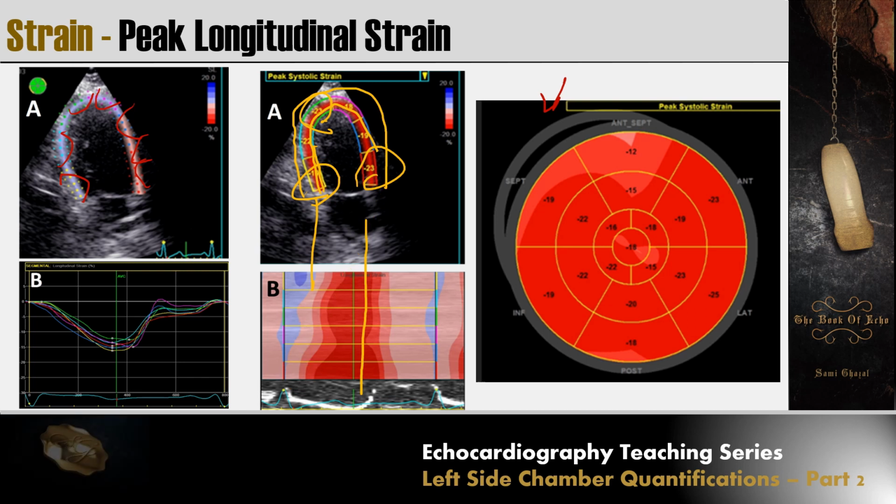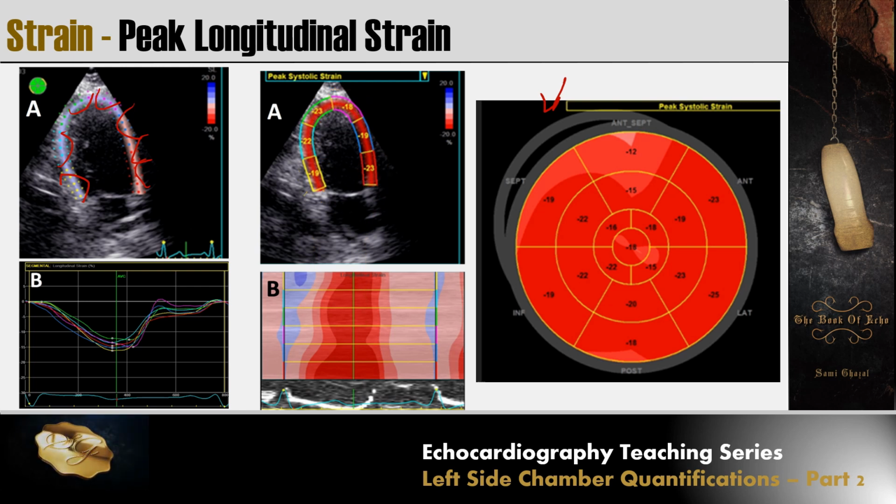Okay, and in this curved M-mode, the normal pattern looks like a red carpet. You have a red in the center. We call it a red carpet pattern, indicative of normal longitudinal strain.